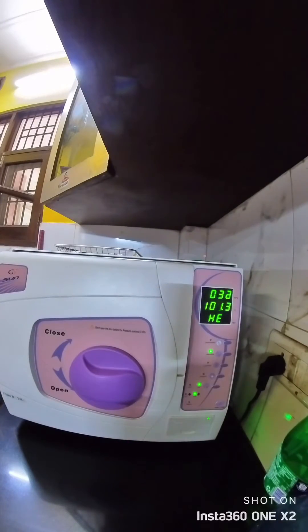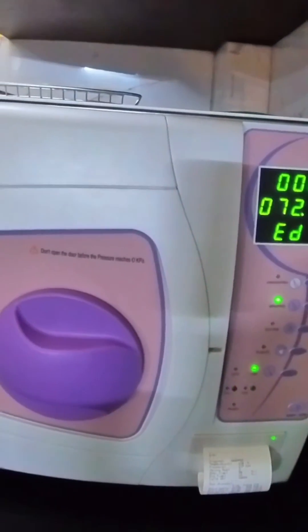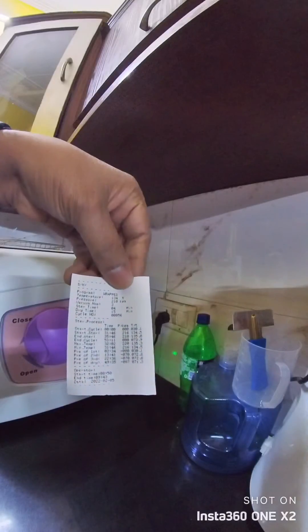Today we are going to review the Sun Medical B-Class Autoclave. Here you can see the time-lapse video of one full autoclaving cycle. It is fully automatic, and the B-class ensures that the equipment comes out absolutely dry. Here you can see a sticker coming out.